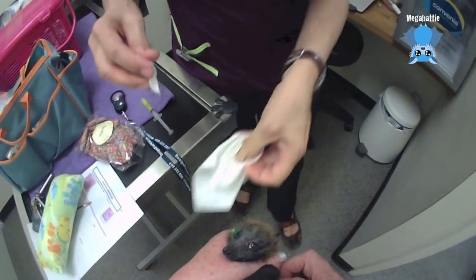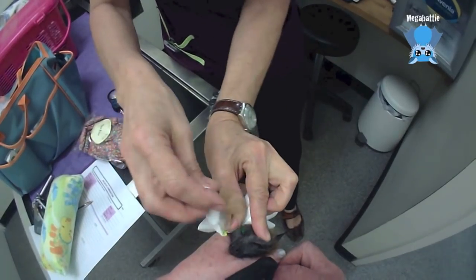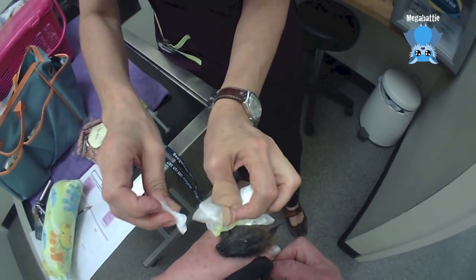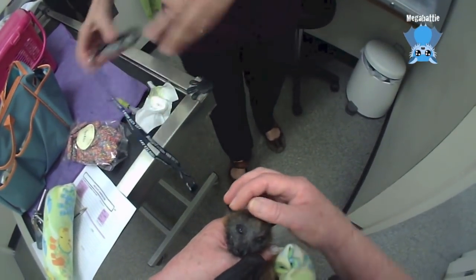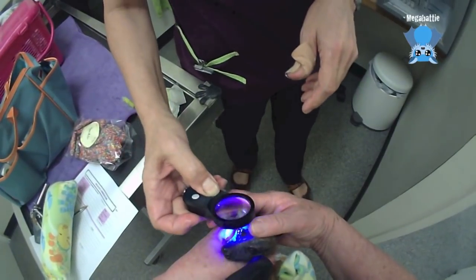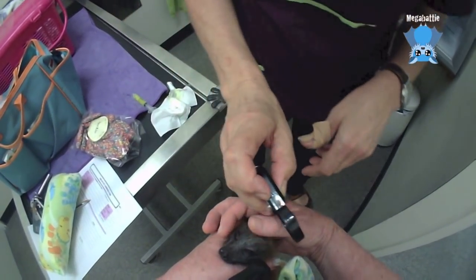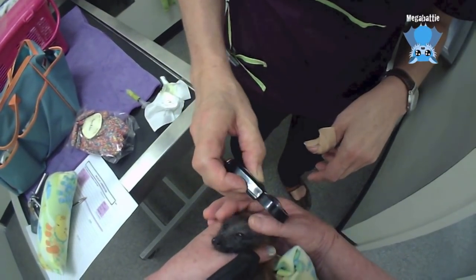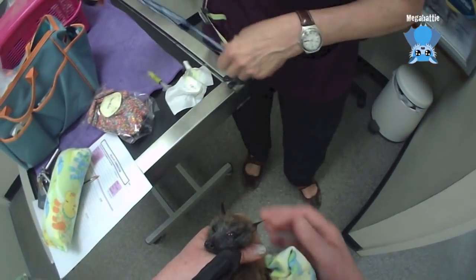She's called Etty, Etty from Ettrick Street. Now that eye — you see zero green — correct, because that eye is fine. The eyelid is a little bit inflamed; you can see how the eyelid is just a little bit swollen. But if you look at this one, you can see that green stuff — that's one huge ulcer.